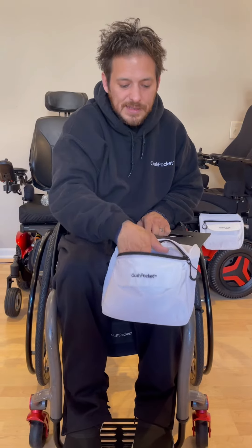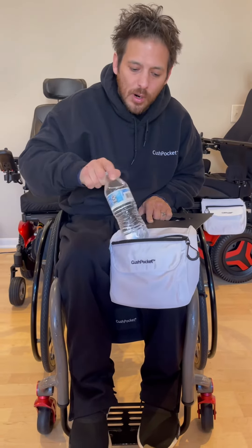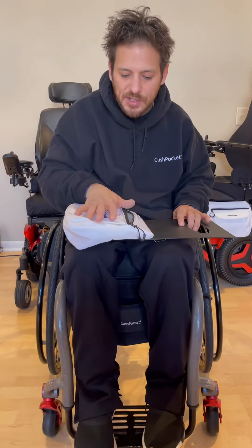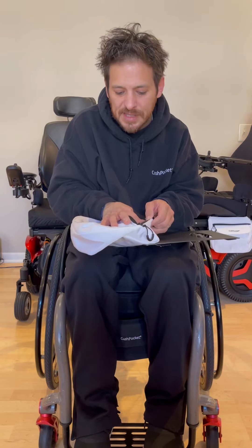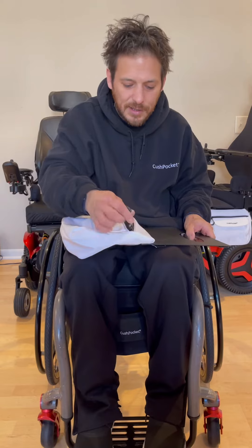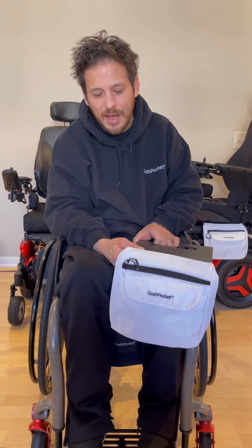The inside is just huge — it's bigger than you think. For example, here's one water bottle and it can probably hold two more. Specifications: it's nine inches total length, seven inches from the zipper down, with two extra inches above the zipper for extra storage. Lastly, I designed the Cush Pocket to look good — so look good when you roll. Look good, push with the Cush, and thank you for your support.